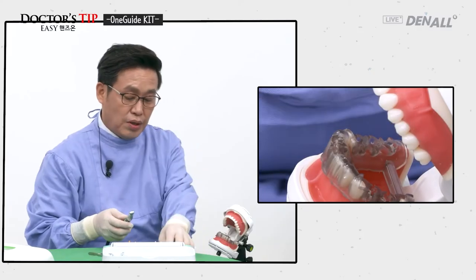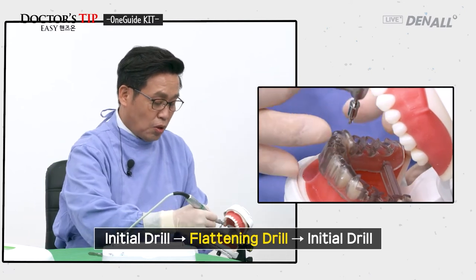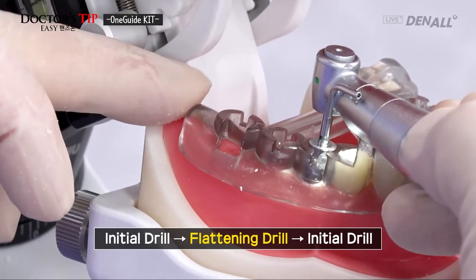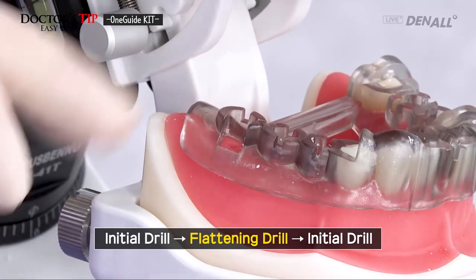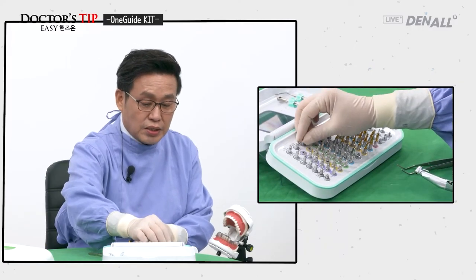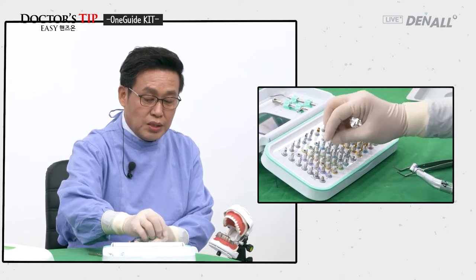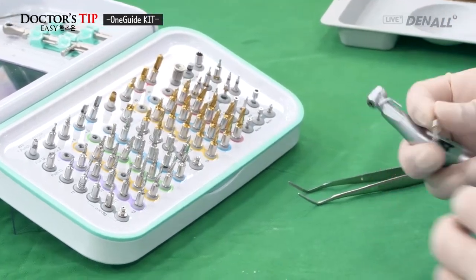Once again, I'm going to use the initial drill with the stopper and drill full length. The initial drill is going in full length. After that, as mentioned, the 3.5 by 10 millimeter drill is going to be used. 3.5 millimeter drill.